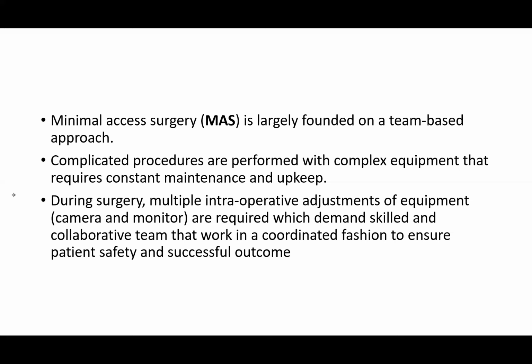It means the knowledge of the basic principles of laparoscopic surgery is the foundation before you go into this procedure. Because it's teamwork, it's not a one-man show. Complicated procedures are performed with complex equipment that requires constant maintenance and upkeep.